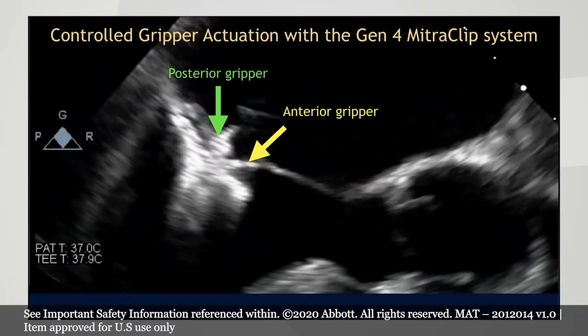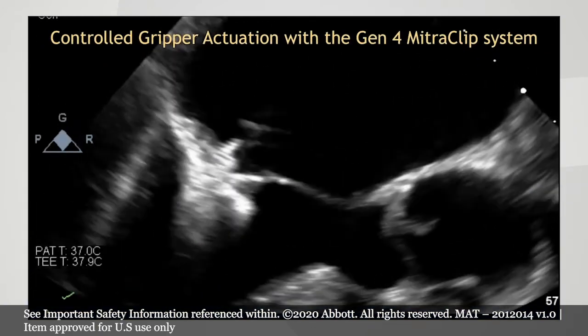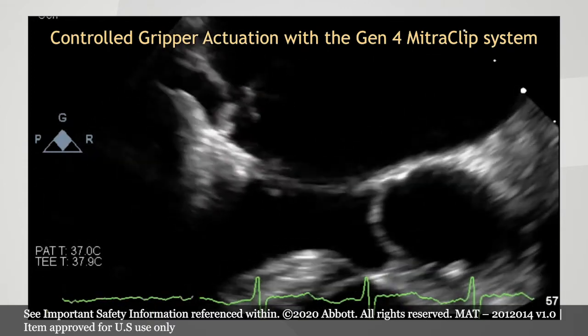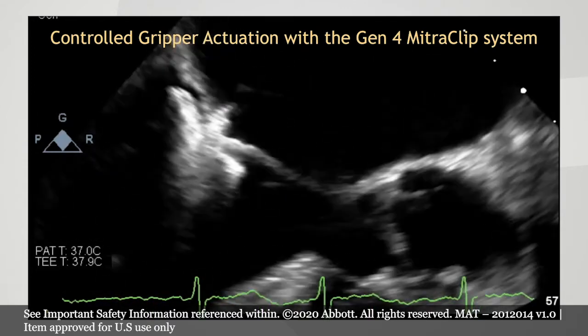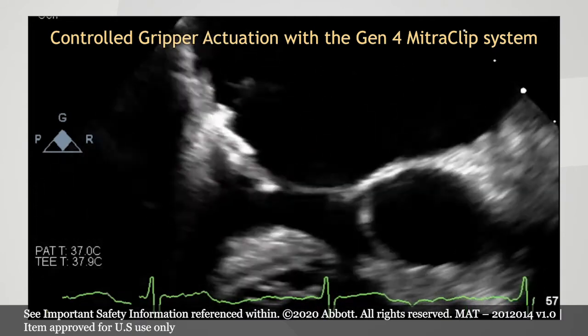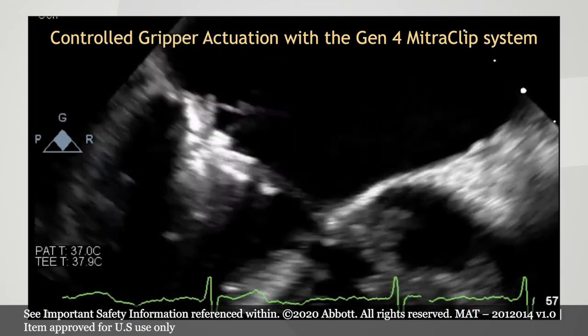Now, the next slide will show a moving image of this, which really indicates the utility and the ability to image carefully how we're using the anterior gripper first and then moving the clip posteriorly to grasp a posterior leaflet. So I'm showing this now in the live image. The anterior gripper again is already down and the leaflet is kind of sandwiched between the gripper and the clip arm. And then on the left-hand side, we're trying to make good contact with a posterior leaflet.